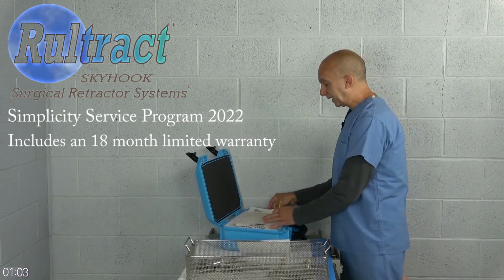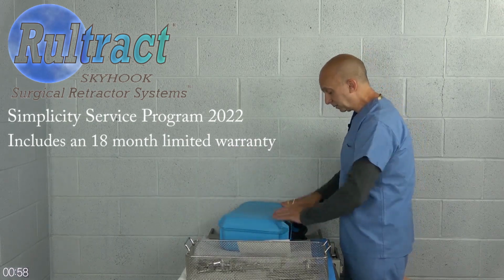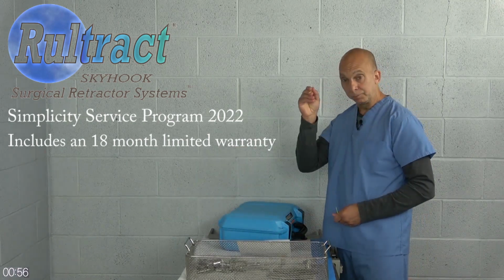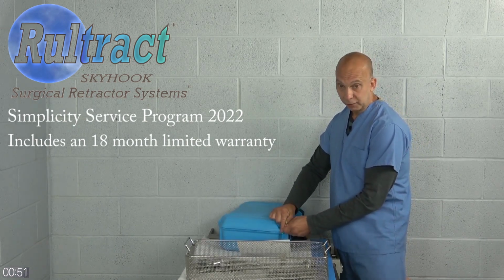So once the equipment and the decontamination form are in the case, go ahead and close it. Make sure the latches are securely closed. Put your zip ties through the holes and make sure that they're zip tied correctly.